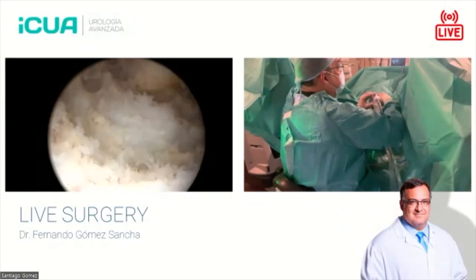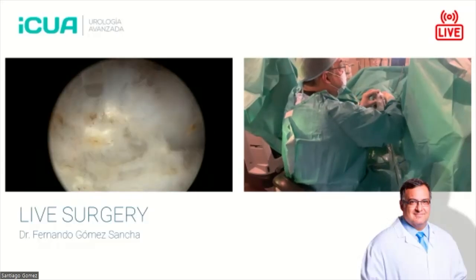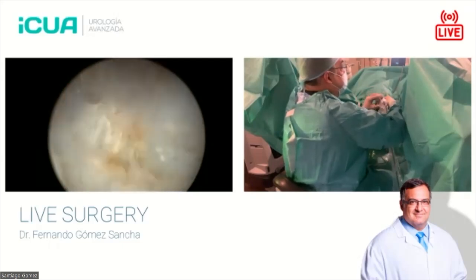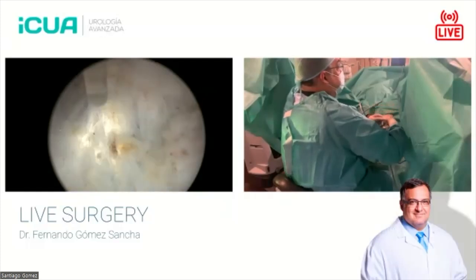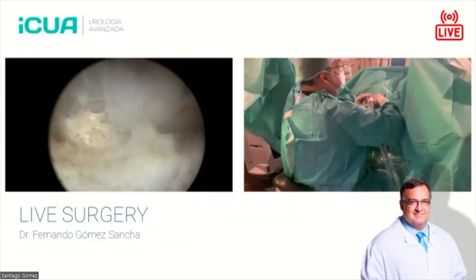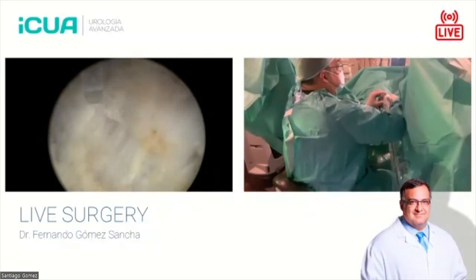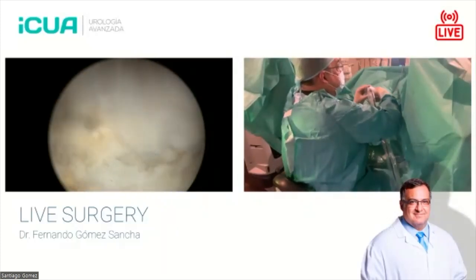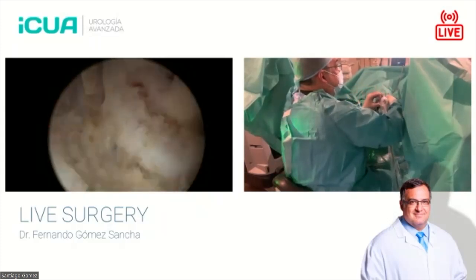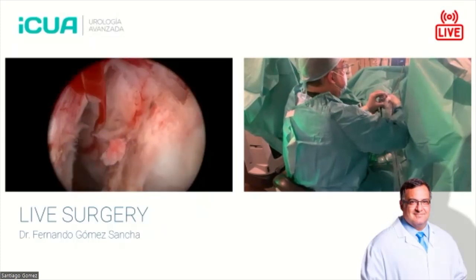We try to have a line that we can recognize. You see, all of this looks somewhat yellow and somewhat, how do you say, the aspect of adenoma, no? Anyway, we try to get these lines that we can follow, because once you have entered in a depth that is compatible with the right plane, following that depth is not so difficult by looking at the characteristics of the tissue. Here, this guy had biopsies, had a high PSA, so probably there are some inflammatory changes there. Okay, we'll get back to that situation there.